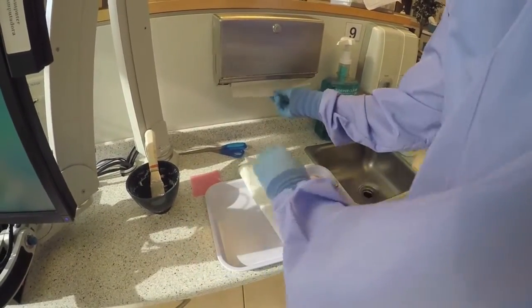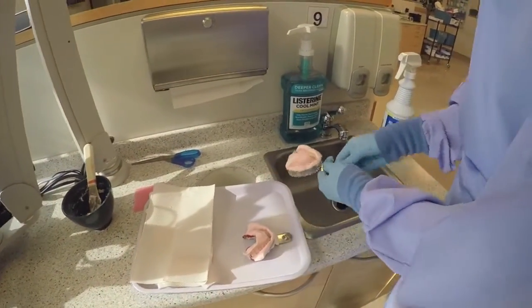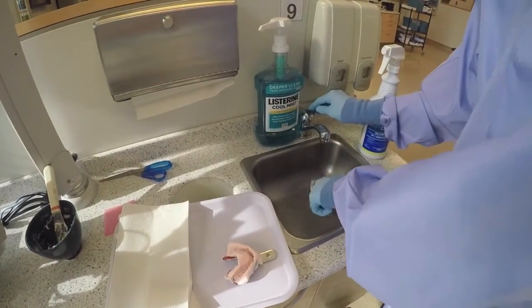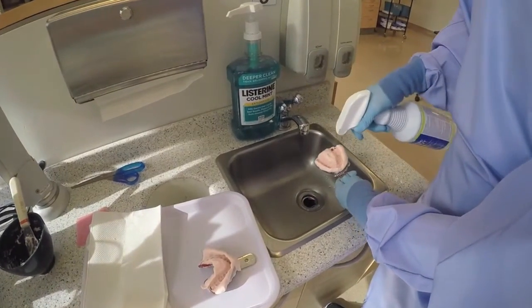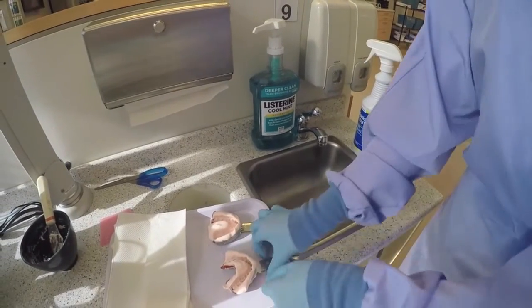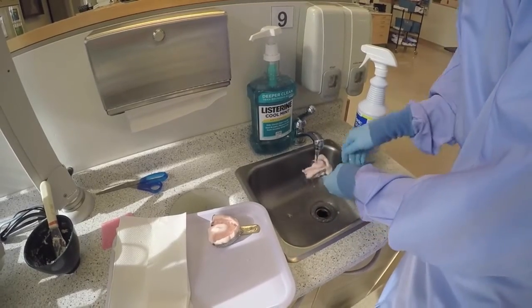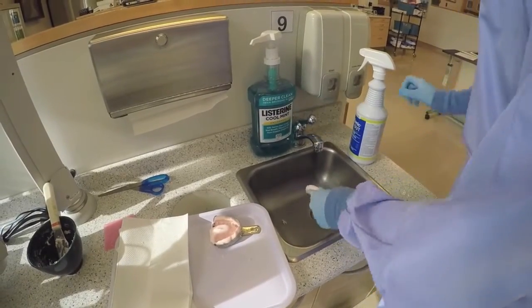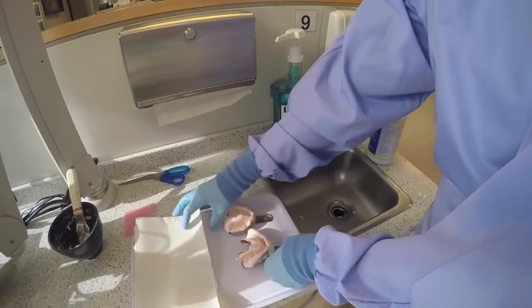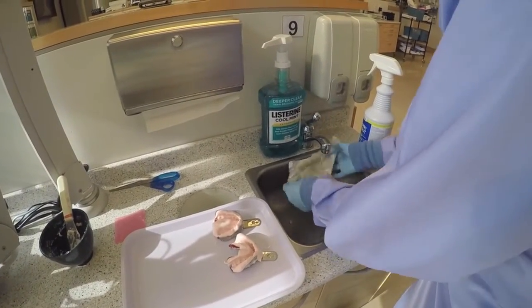Gather some paper towels and a bottle of sterilizing solution. Rinse the impression under water to remove any possible blood or food debris. Then spray the impression with the solution. Wet the paper towels and wrap the impressions to prevent the impressions from drying out.